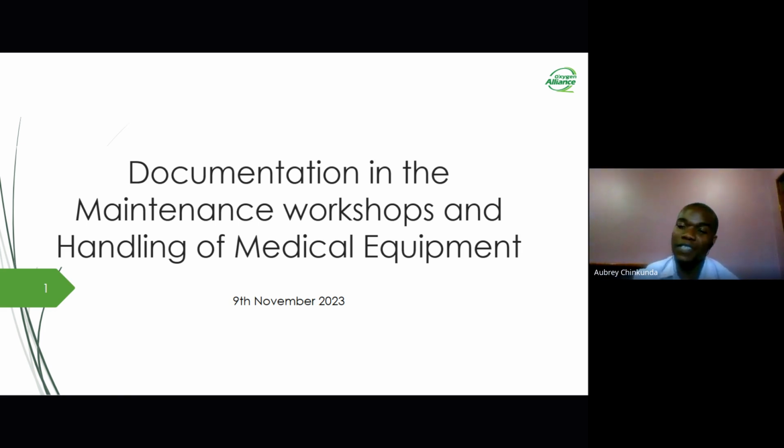After we have tested it, if that solenoid valve is not working, we go back to our documentation and see if there are any mistakes that we have made. That's a miniature version of it, but all the projects that we conduct here under OpenNode 2 or at the Global Health Informatics are documented so that everybody else can have information on how that project was done and follow up.